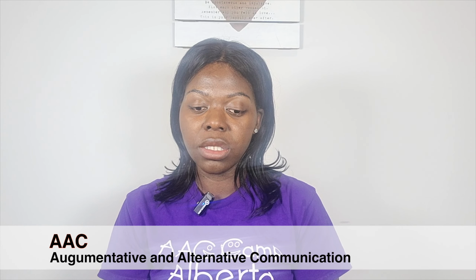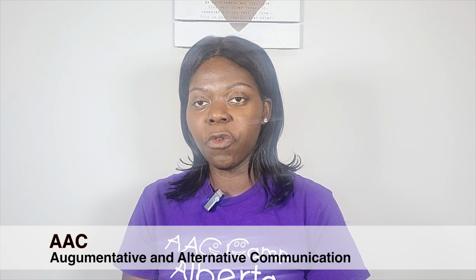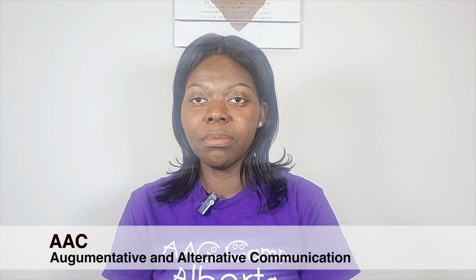The device that I just used to do the introduction is called an AAC device. AAC stands for Augmentative and Alternative Communication, a system of strategies and tools that replaces or supports spoken language. It is also known as augmentative and alternative communication devices, right? So that's what the short form is, AAC. I'm going to be using that mainly in today's video.